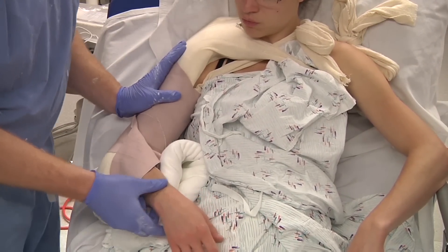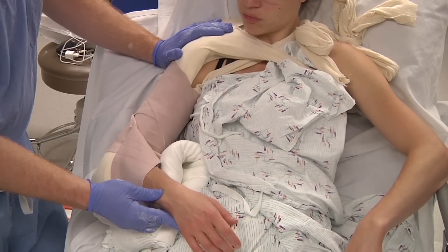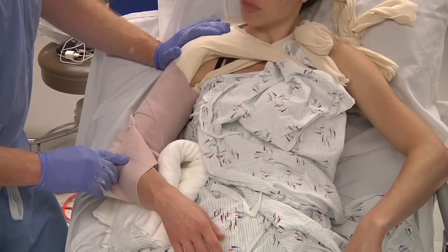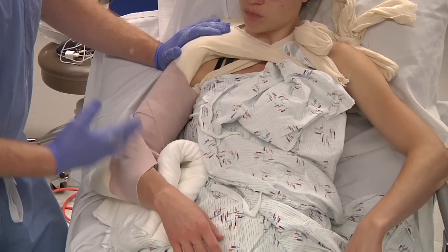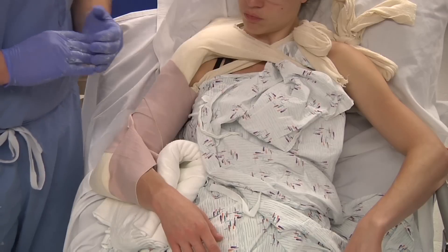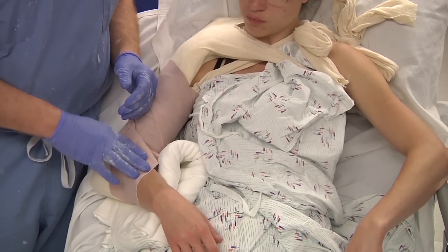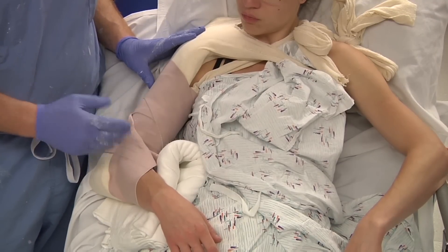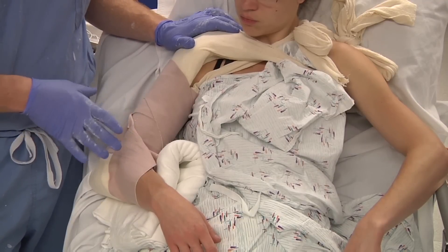After this, generally a sling is applied to the patient. One of the main factors to note is that after your splint is applied, it is critical to do a neurovascular exam — to reassess any change in neurovascular function, with primary concern about the radial nerve and radial nerve function. As with manipulation of the fracture, the nerve can become entangled or entrapped within the fracture site during your reduction. Let your nurses know that over the next period of time, if the patient starts complaining of any neurovascular sequelae or symptoms in the hand or up the arm, the physician should be made aware as soon as possible. If there is any change in neurovascular exam, the splint can be removed, a period of watching should occur, and reapplication of the splint if appropriate.